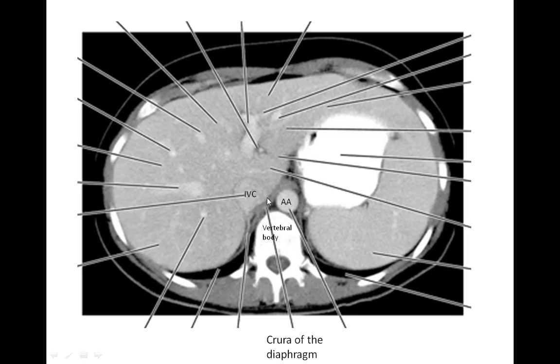We can't see the portal vein here because the portal vein has already branched and passed into the liver. So some of the vessels visible here may be hepatic veins — the branches of the portal vein are spread out amongst the liver.